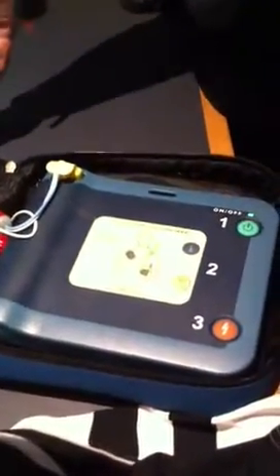Okay, so you always open it up and there'll be a button to turn it on. So Karen, can you see that? It's nice and easy. Okay, green button here, it just says on off, so we switch it on. Easy, okay. And you listen to it now.